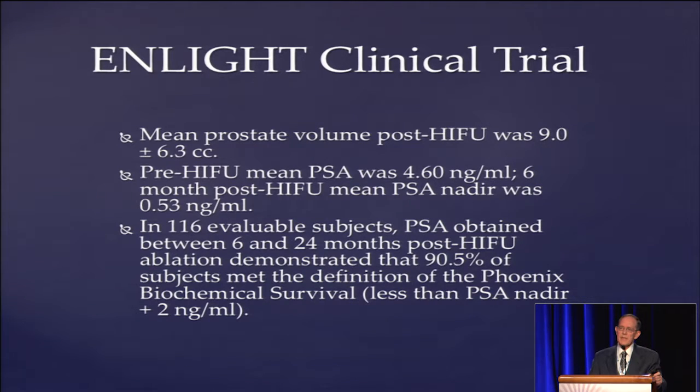I think it was important to say that when you have an innovative technology, you need to recognize that you're fighting upstream against tradition and against entrenched viewpoints. And one of the issues that came up with the prostate device applications was that the indications were for a disease, not for a device, not for a tool. And because of that, the usual and traditional approaches of comparators were 10-year follow-up survival data. I would submit that was unfeasible, and to the credit of the FDA, they recognized that and went a different path, which has been described carefully by the FDA at this meeting.